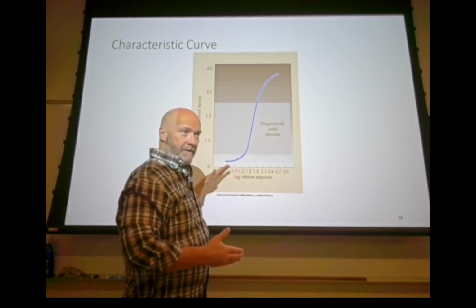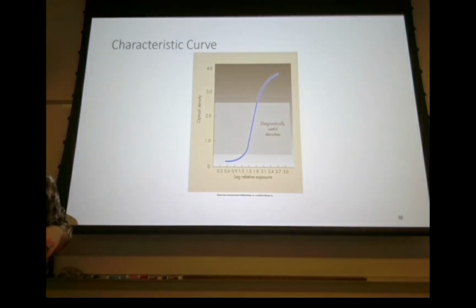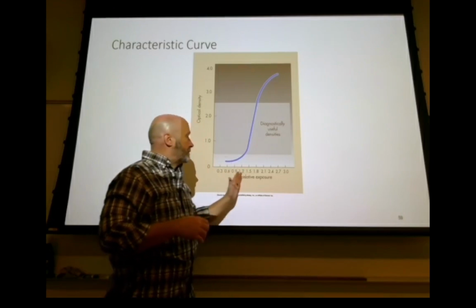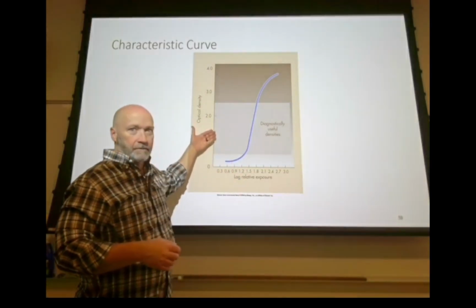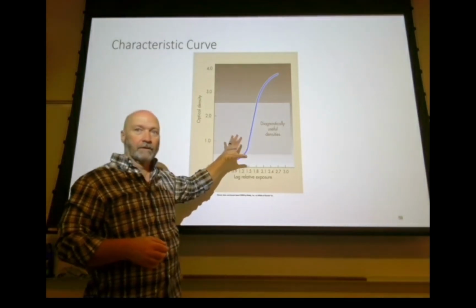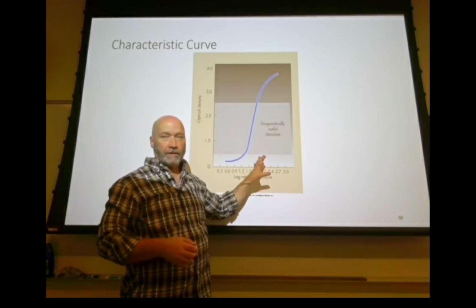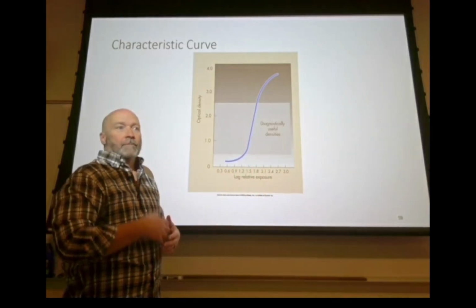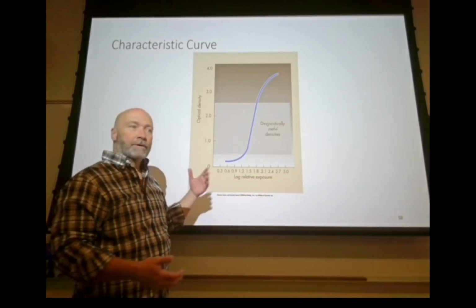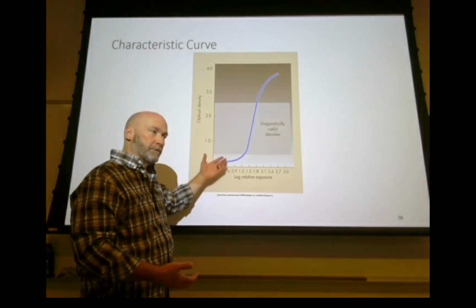So that's really how your image receptors work now, in that for every unit of exposure you get a unit of recorded exposure, but it's not until they apply the H&D curve or the stored histogram that you actually get your contrast out of it, okay? But your raw image should kind of reflect that to a degree. 1 unit of exposure gives you 1 unit of density, 2 units of exposure gives you 2 units of density, and things like that.